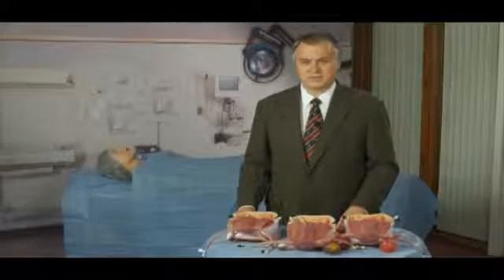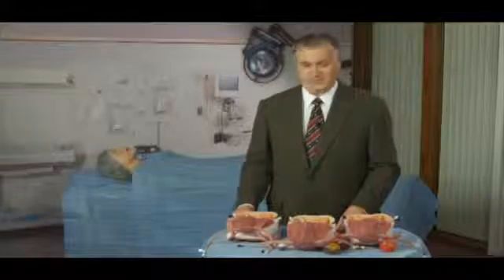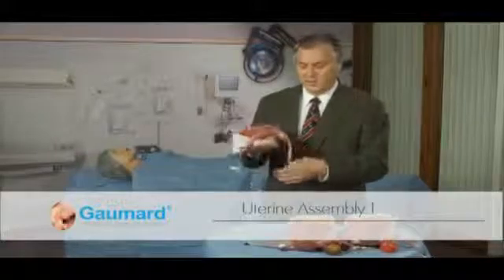The gynecologic procedures on Surgical Chloe will be performed on interchangeable uterine assemblies. Here's an example of the normal uterus, called uterine assembly number 1. The normal uterus has an ectopic pregnancy. It has a normal sized uterus.